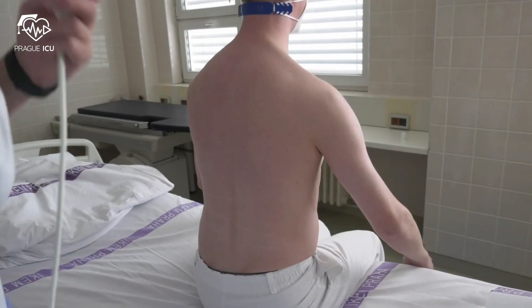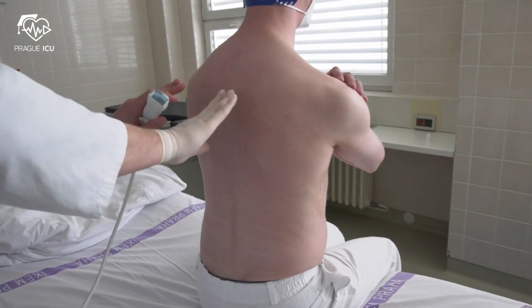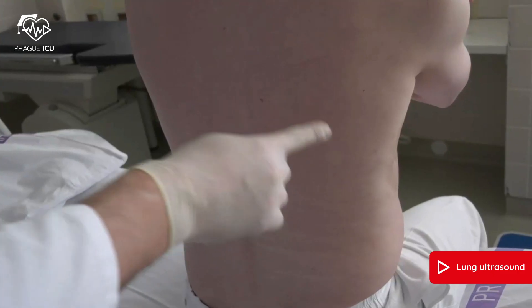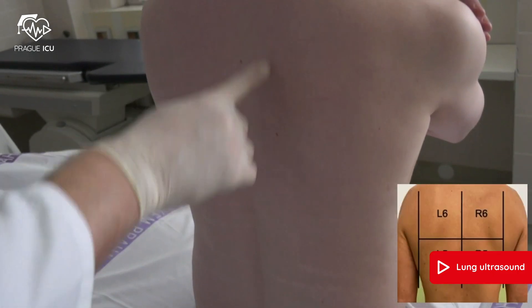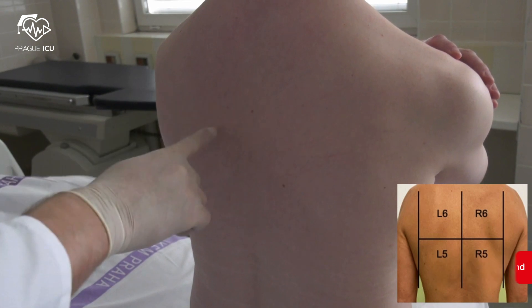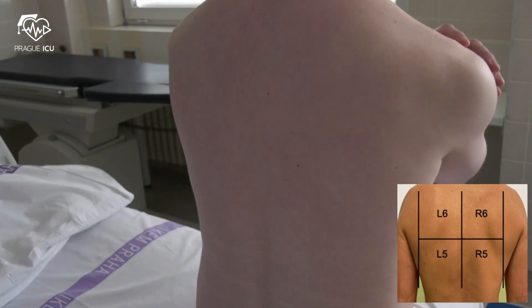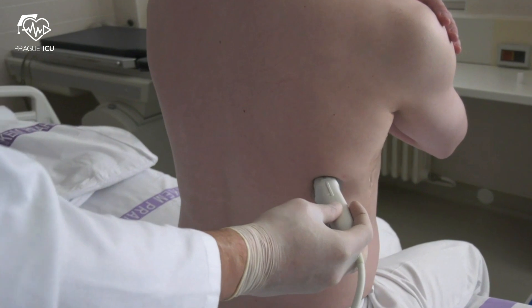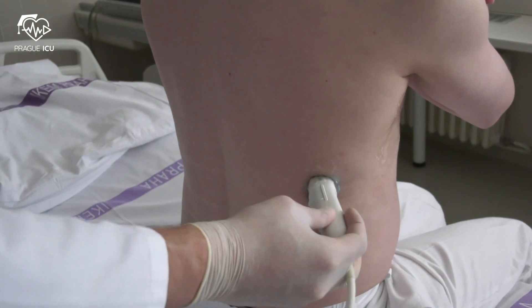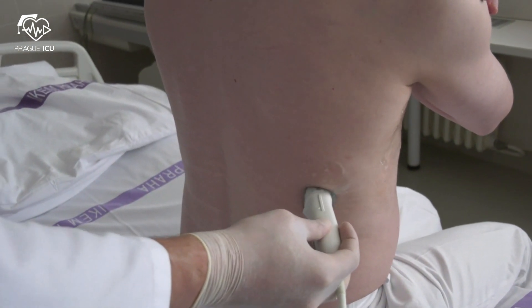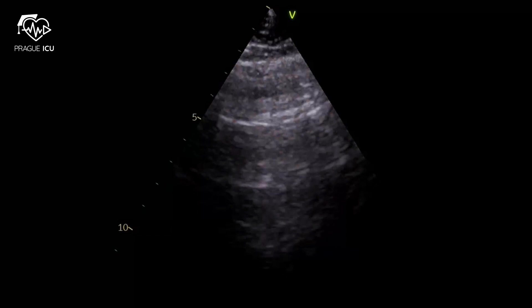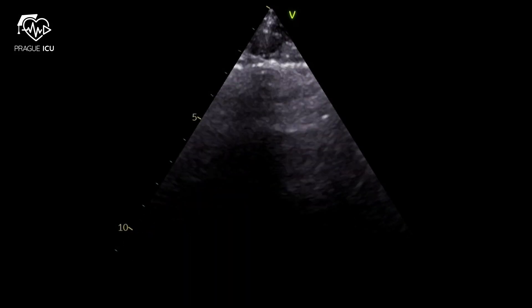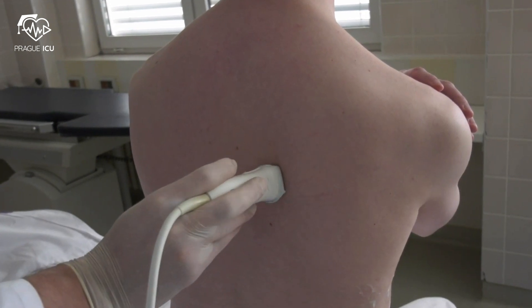Finally, the posterior chest is divided by the midline at the spine and the posterior axillary line, and can be divided into superior and inferior zones. To position the patient, we have them wrap their arms around themselves, which pulls the scapula out laterally. Here we can appreciate the nice hyperechoic structure which is the pleura and A-lines, suggesting a well aerated lung.